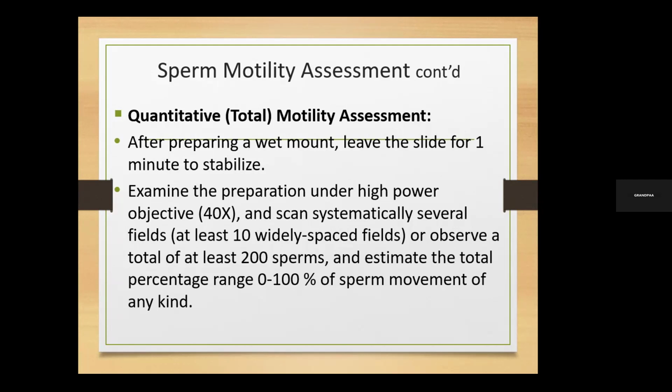You will perceive it as dead, but it may not be dead. So you are going to do what you call a vitality or viability test to indicate whether the one lying there is actually dead or just like in a coma.